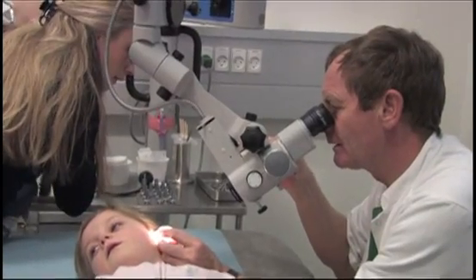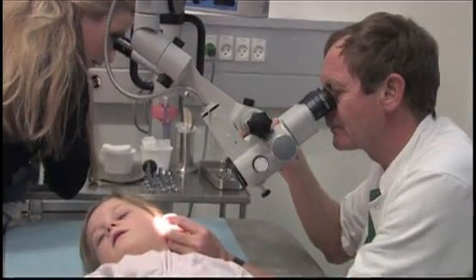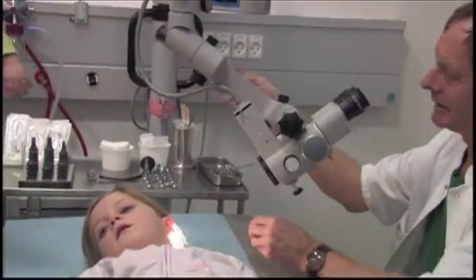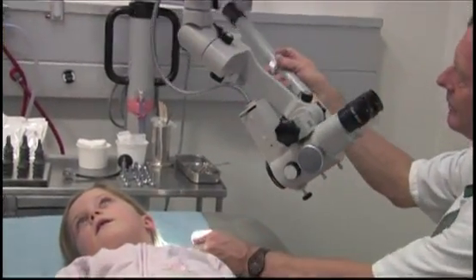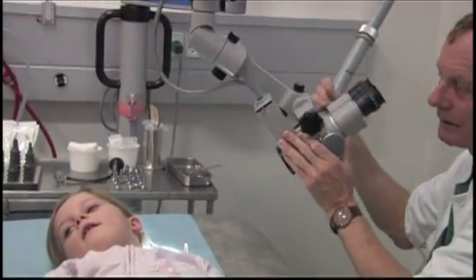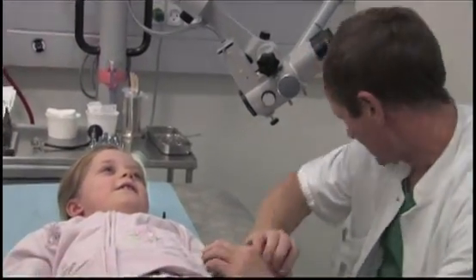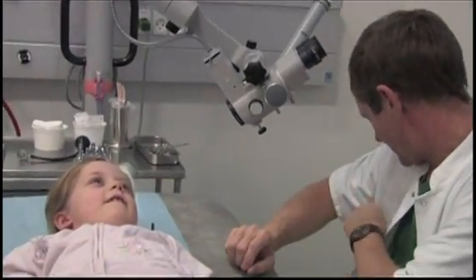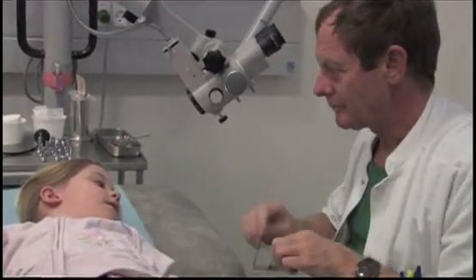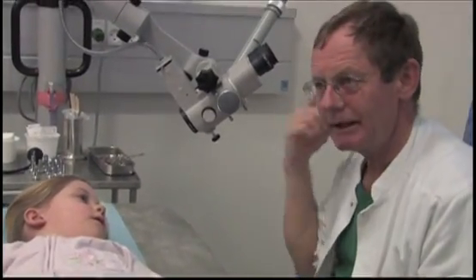The philosophy for treatment of glue ear is to equalize the vacuum of the middle ear. One way to equalize the vacuum is to inflate a balloon through the nose. This procedure produces a hyperpressure in the nasopharynx which will open the blocked eustachian tube and equalize the negative pressure in the middle ear.